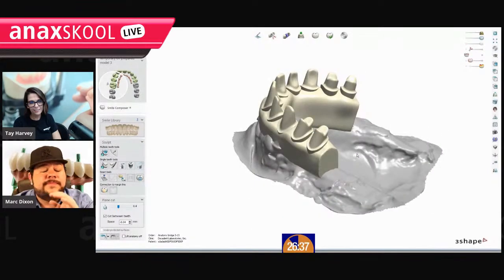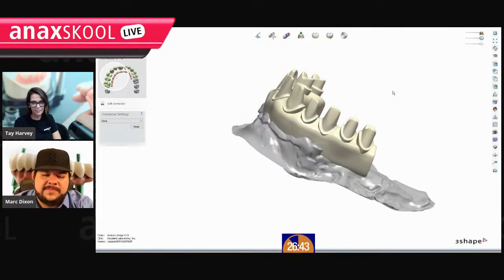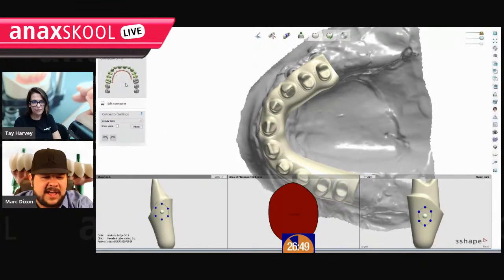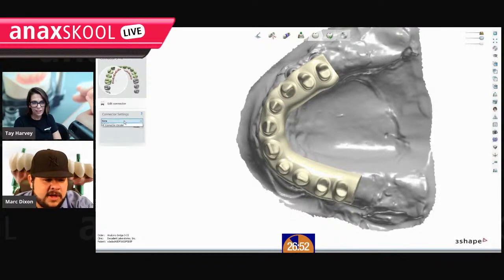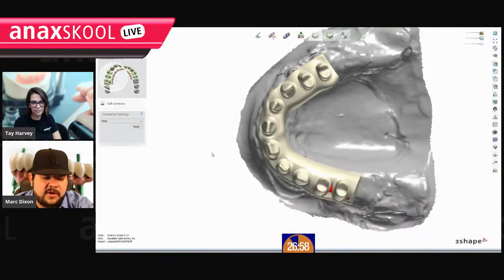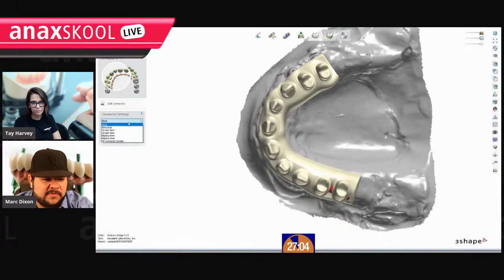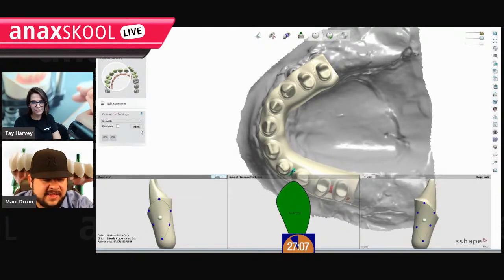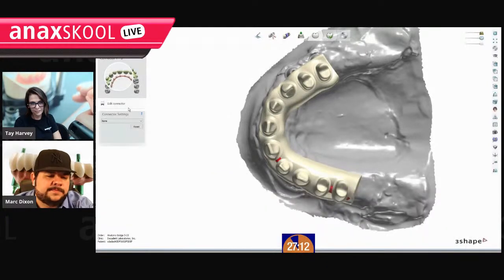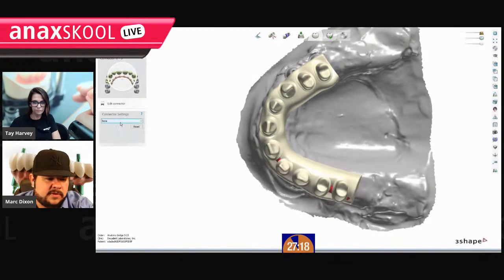So let's pretend this looked fabulous. This is what we want, right? We want to build the crowns over it. They have to be connected, so it's a bridge. We have to go to the connectors real quick. That's one drawback: we have to have connectors between each one because they have to be touching. But we don't want them touching, so we'll put connectors in there. That one's fine. That's why I grabbed the 6mm cylinder instead of a whole profile silhouette. Not necessary. Just something quick. It would have been nice if, in the order form, I had chosen to make them all this, but I didn't.